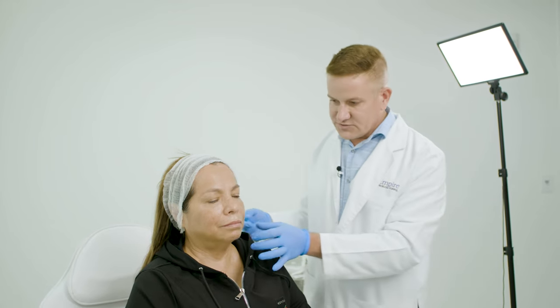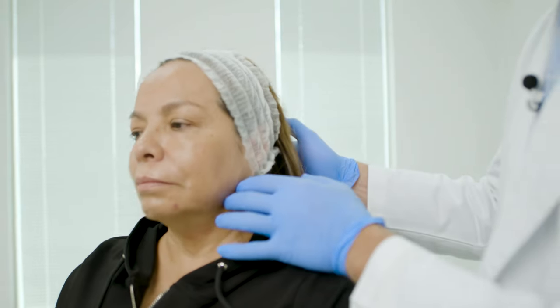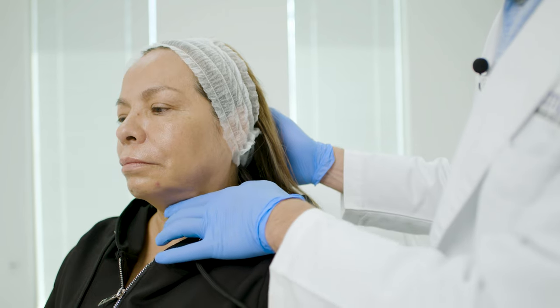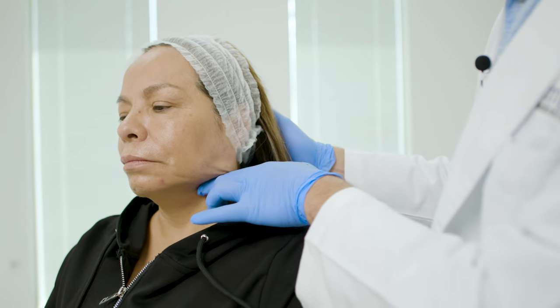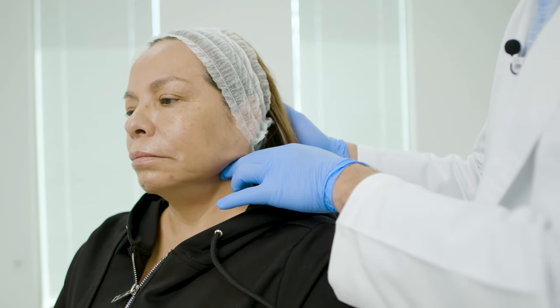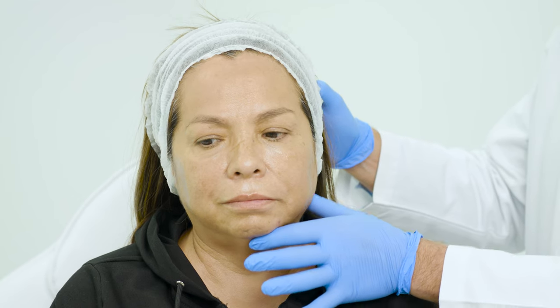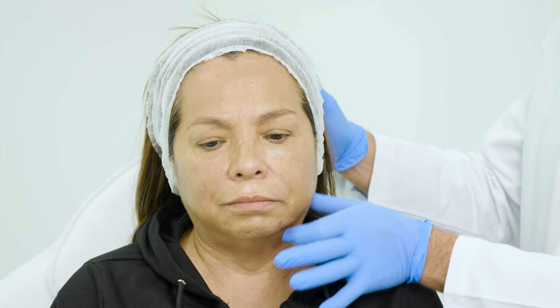We could also use a PDO lifting thread — a cog or a barb — where we would anchor it back in this area and direct the barb to the submental region and pull it back. They have this in the Alari thread line with different lengths of threads, and they have molded and cog threads that provide a nice lift in that area, allowing us to address the lower face at the same time.